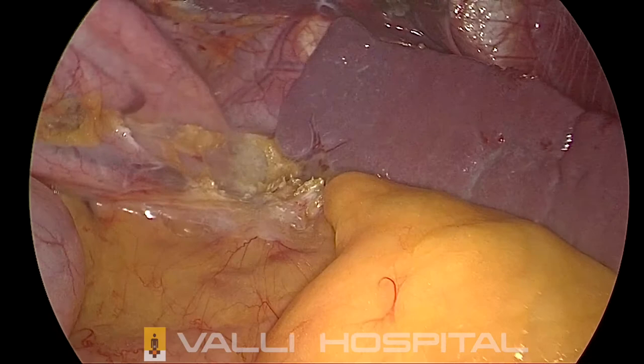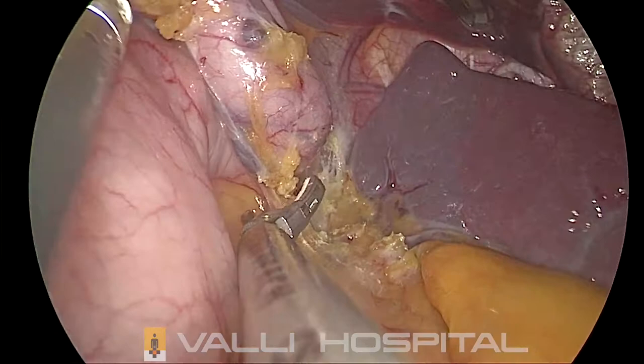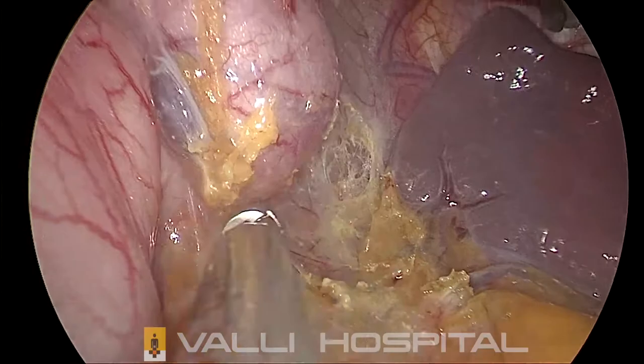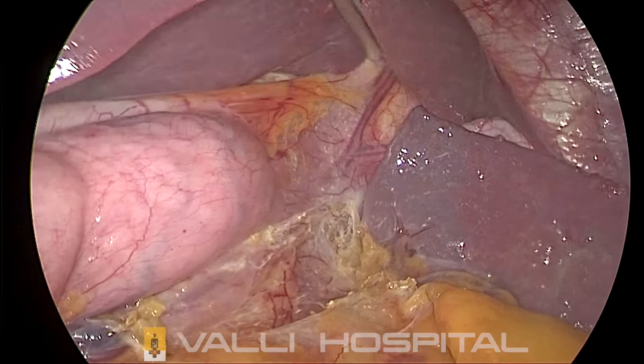Then migrate your forceps. Then the traction and counter-traction is very important here. Divide all the attachments. You have to free the fundus fully. Then only you can do a better wrap. Here again, sharp dissection and the blunt dissection.